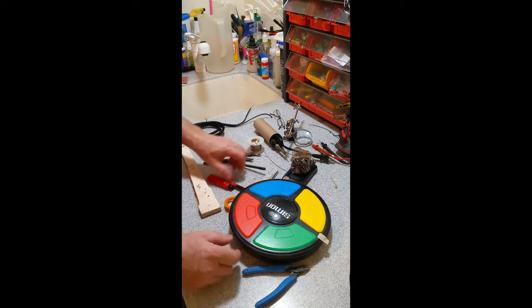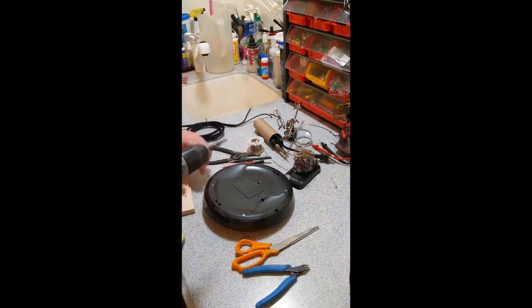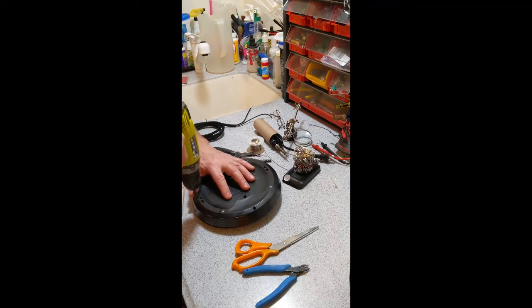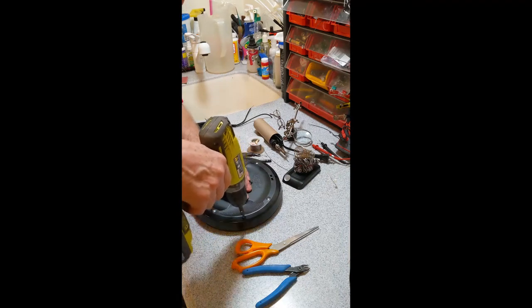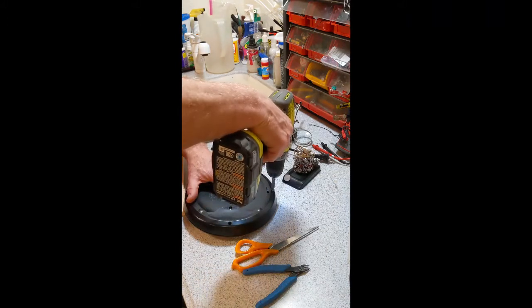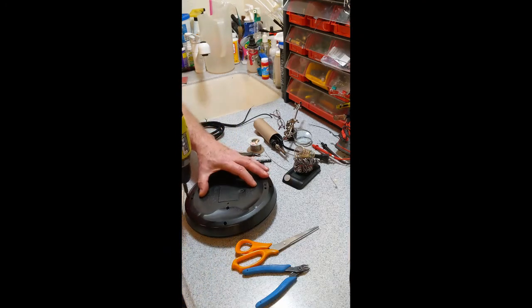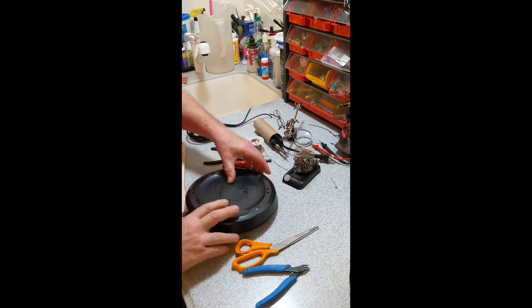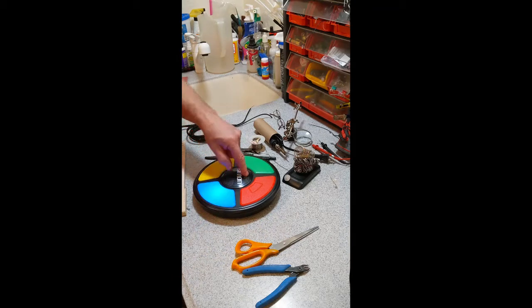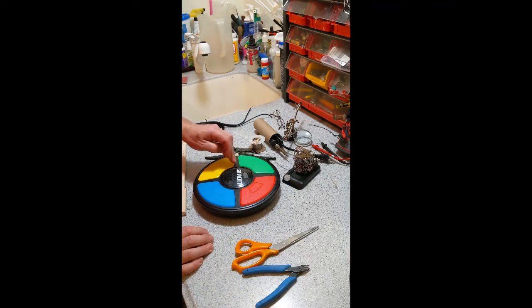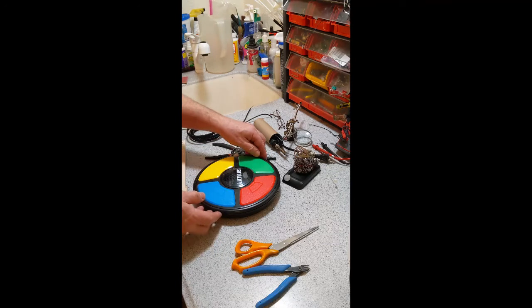Let's open Simon up. Get the cordless drill. There's six screws that hold this back on. This is a brand new Simon out of the box. Turn it over so that they all fall out. This is functioning Simon, fresh from the store. We could play the game, but we're not going to. We're going to take it apart.